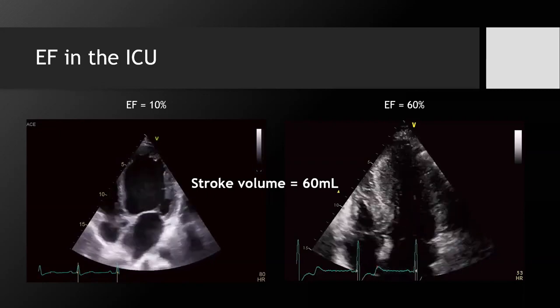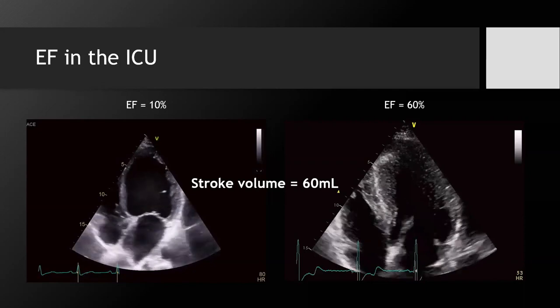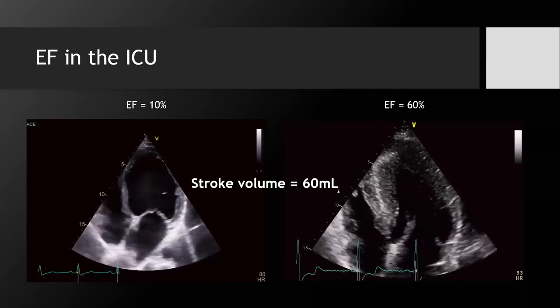Maybe even if you don't have a previous echo on this patient, but you know that they're ill and you don't have any records, and you see that their stroke volume is normal, you might think that maybe this is not the most important point.